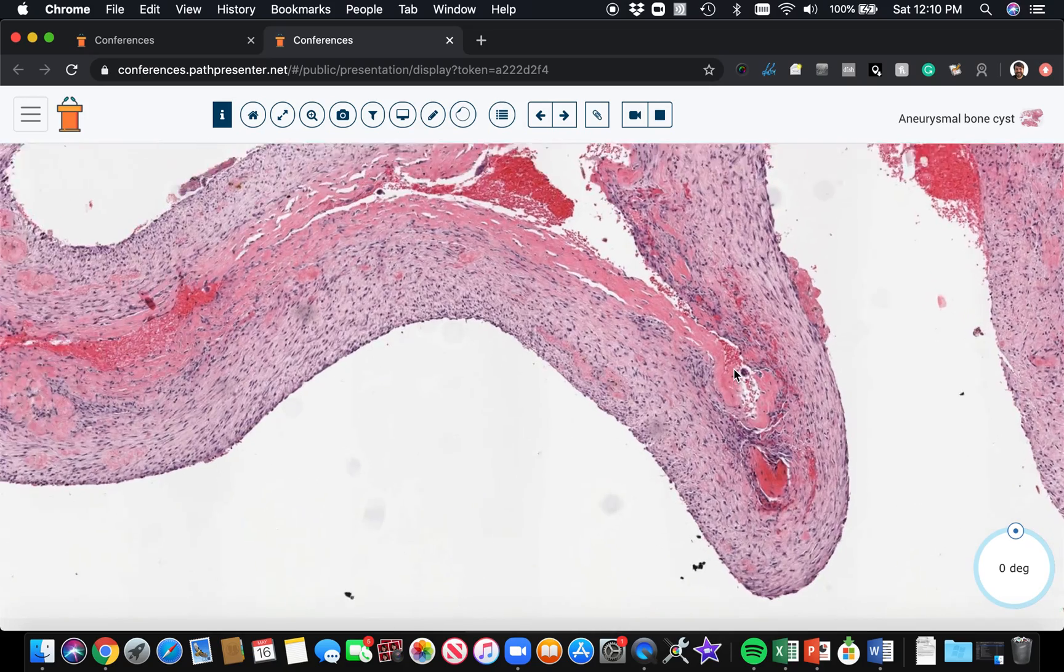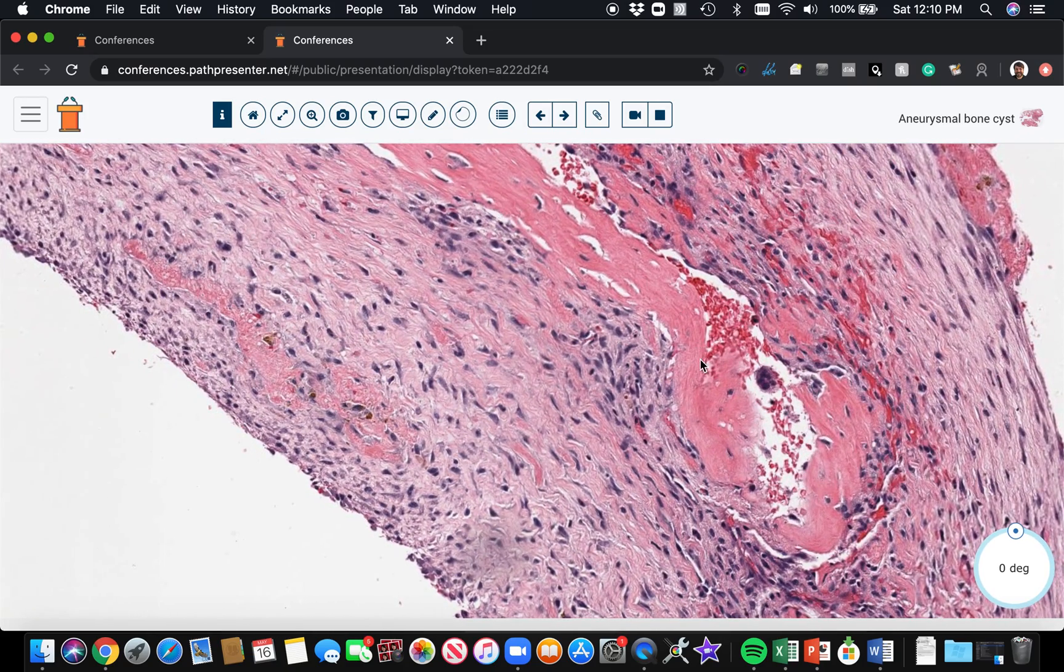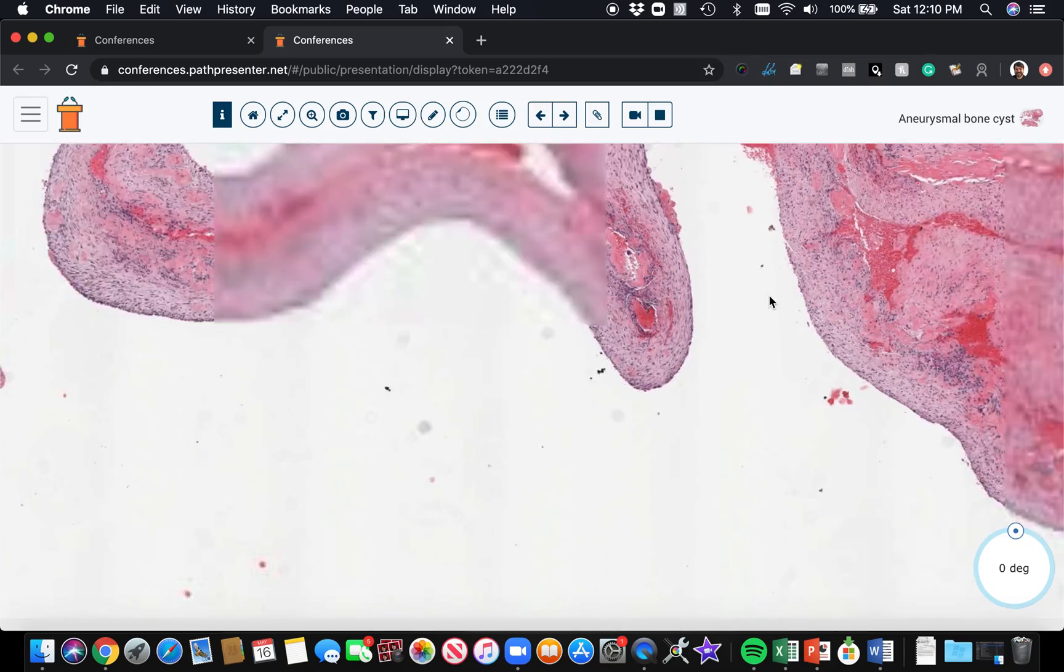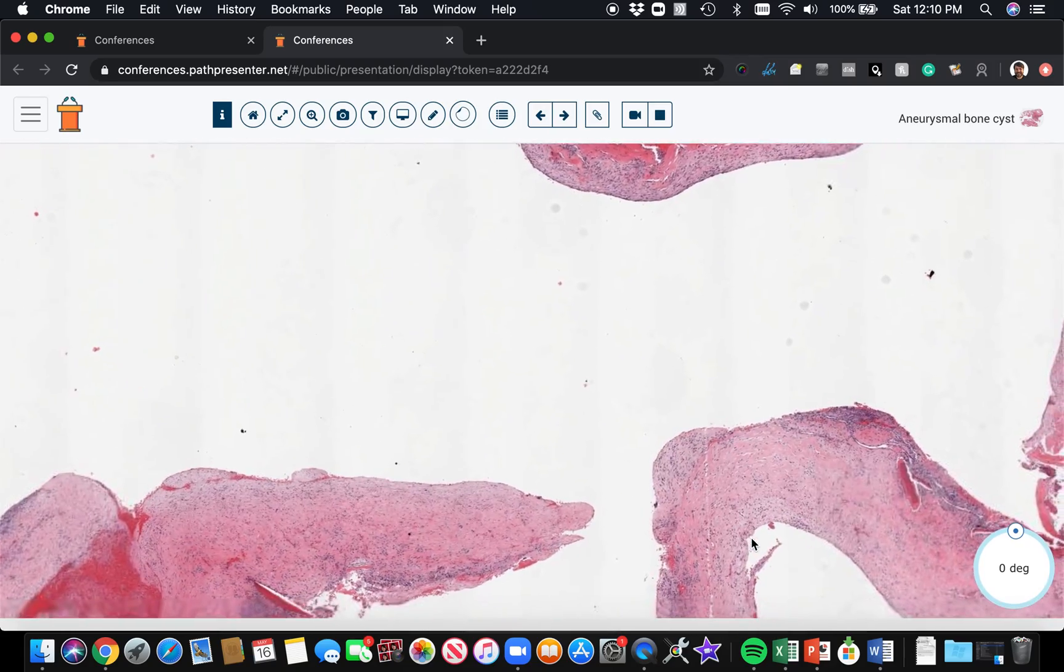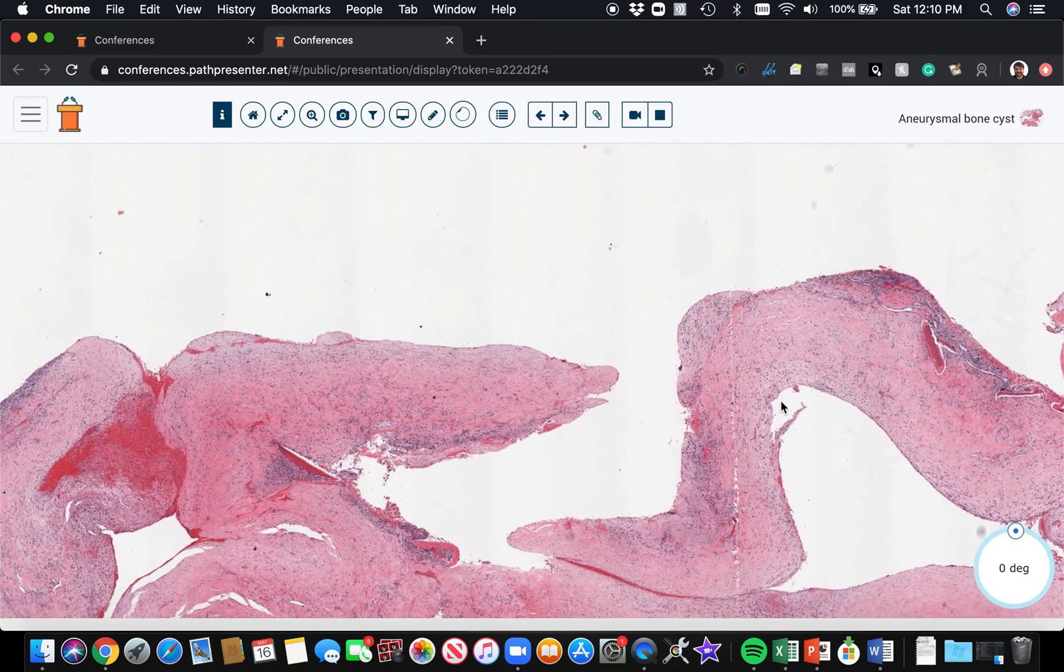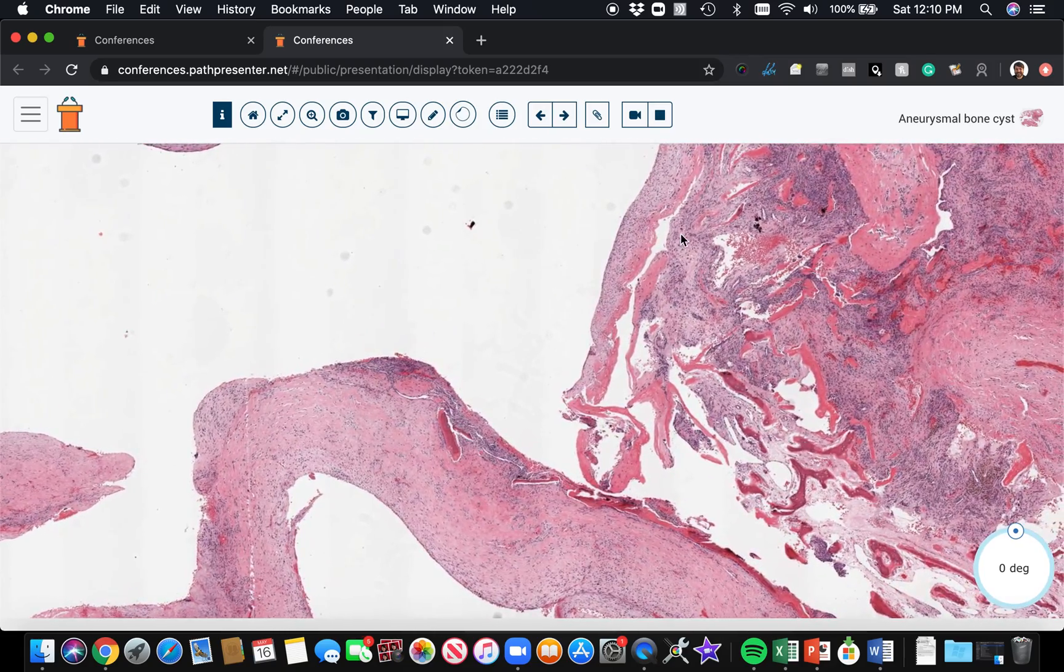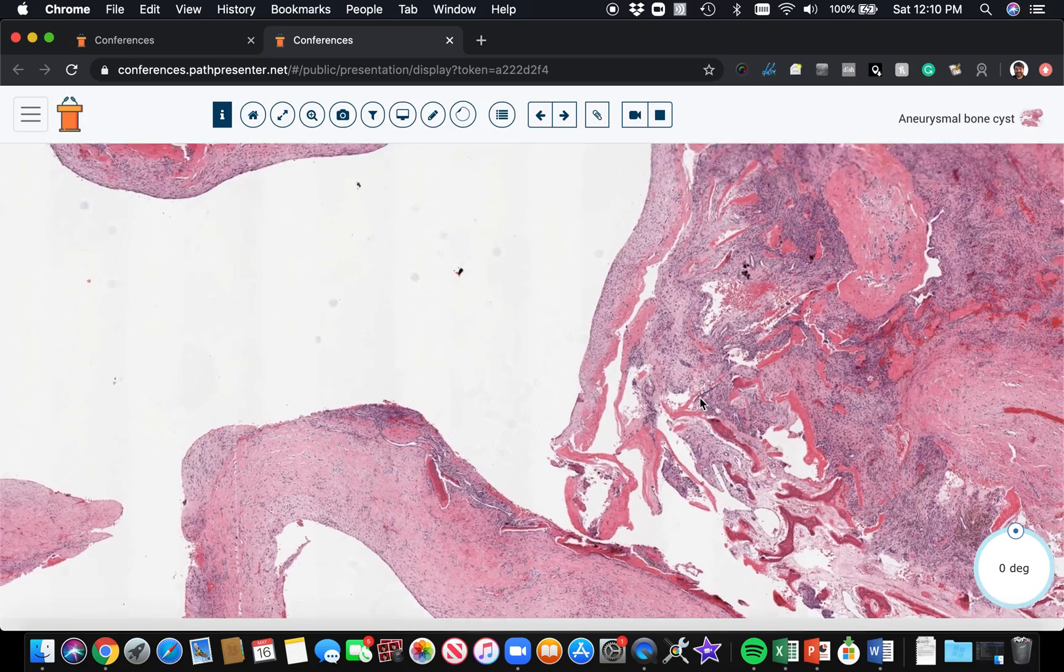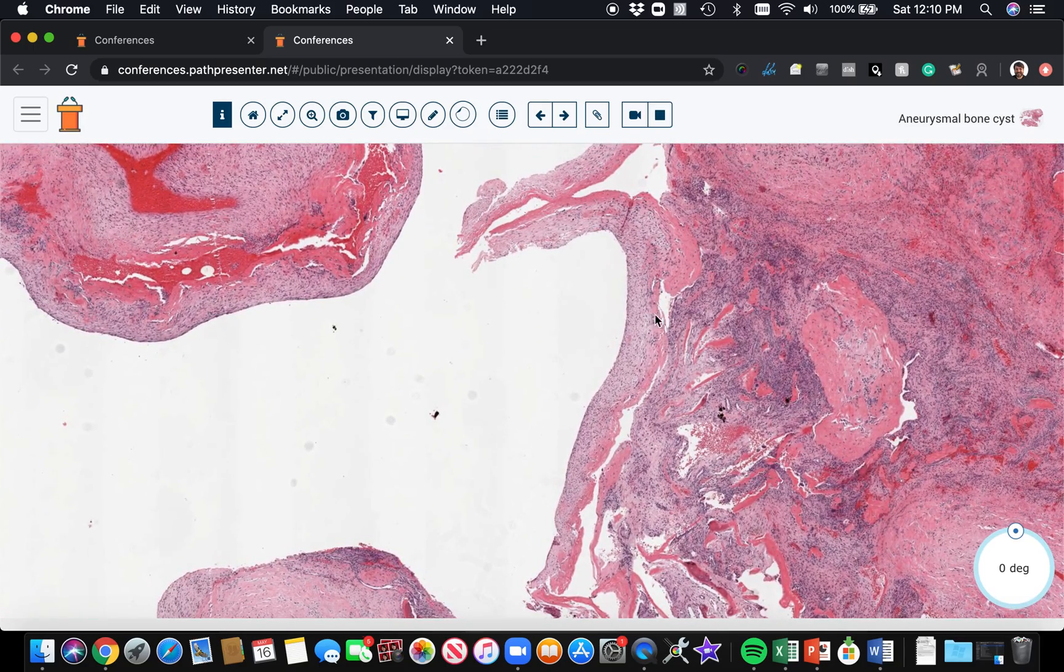And sometimes actually true osteoid. See here you can tell that this is osteoid - it's beginning to make bone. And the osteoid production often kind of forms these parallel linear arrays in the wall of the cystic space.